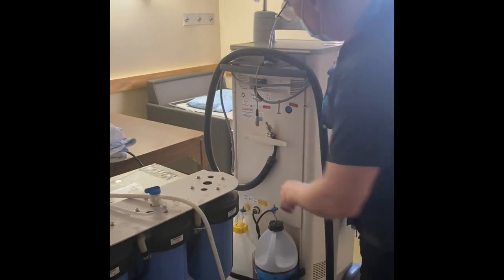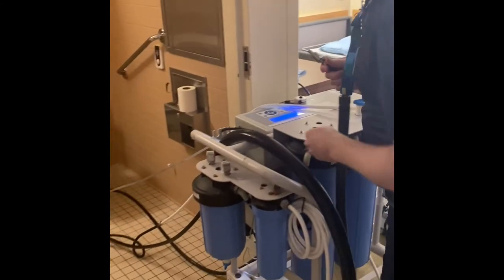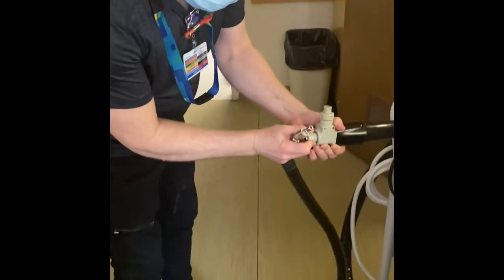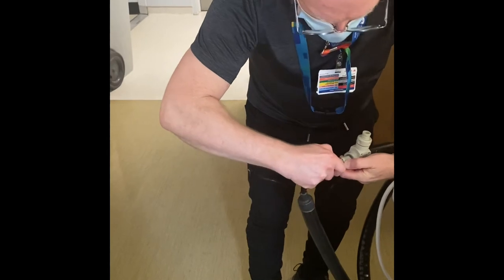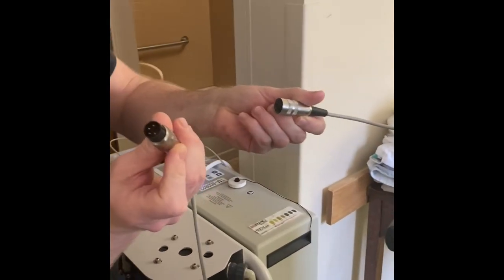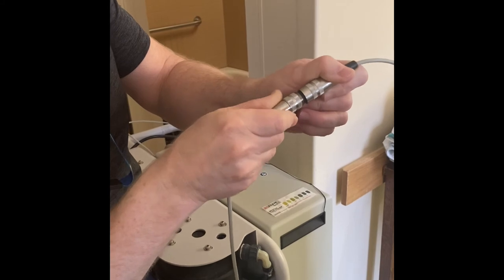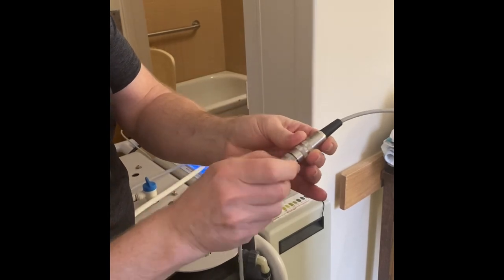Next, connect the water supply from the Aqua Uno to the dialysis machine — remember to keep your connectors clean and off the ground. Pull the collar back before you connect the hose in. For the interlink between the Aqua Uno and the dialysis machine, you have to line up the pins inside with the socket — it's pretty delicate. Then screw the collar tight.